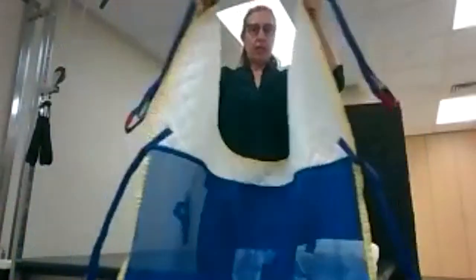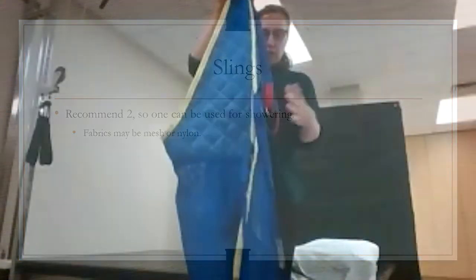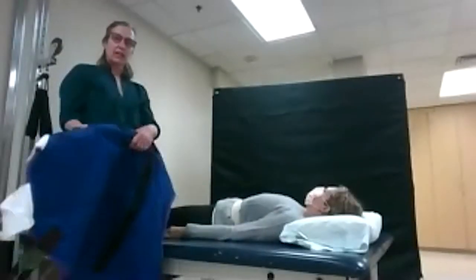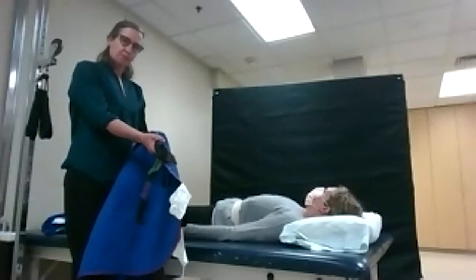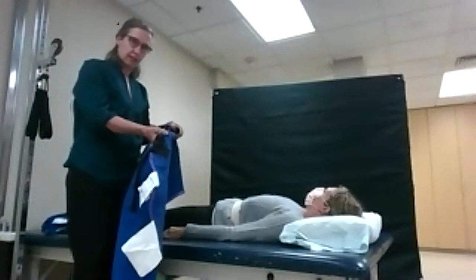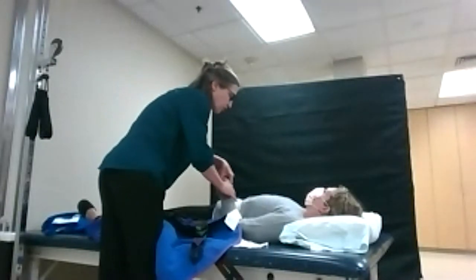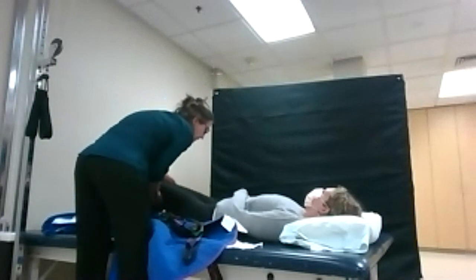Same idea — split legs and a mesh system, so two slings would be ideal for showering. Next, we're going to go over how to put the sling on when you're in bed and how to lift somebody out of bed when they are maximally dependent on transfers. I'm going to go over how to put the sling under the individual when they're lying in bed, and we'll go through hooking this individual up to a patient lift system. The rolling technique we just discussed is critical to make sure that you can maneuver the sling device underneath them.